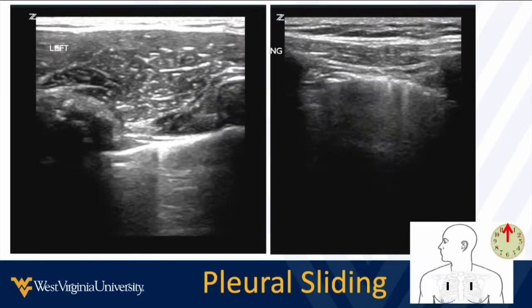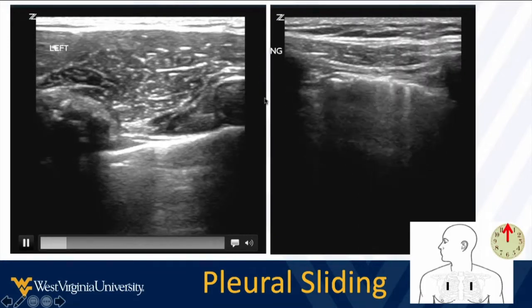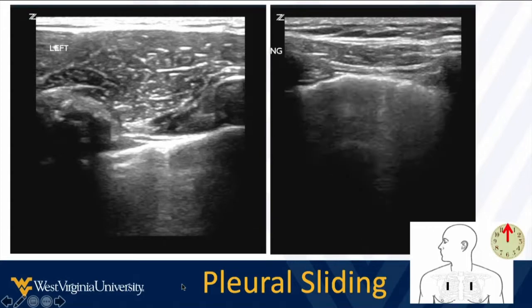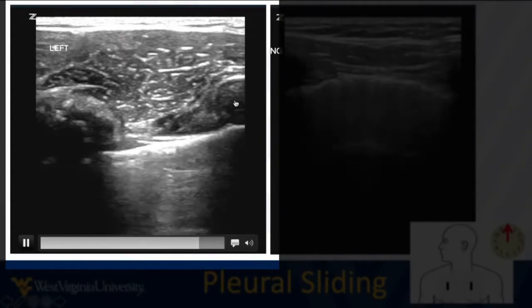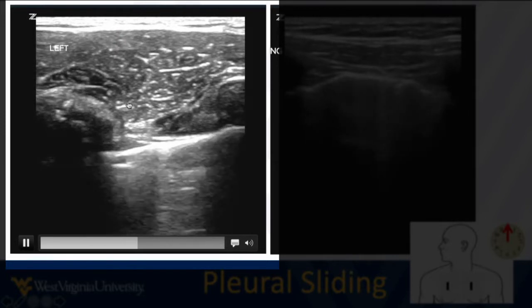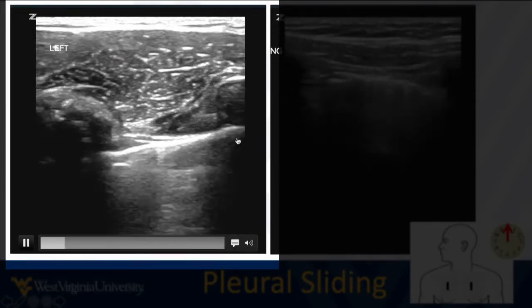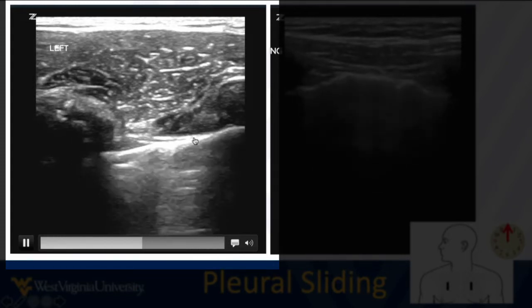Let's go ahead and take a look. Now, here's what that may look like. Our depth, I cropped the markers off of here, but the depth in these images is at about 4 or 6 centimeters, depends on how thick your patient is. But we should see ribs that maybe cause some shadows. This is all chest wall, which hopefully is pretty stationary. And then here we see the pleural line, and it's sliding. It goes underneath the ribs, slides back and forth.